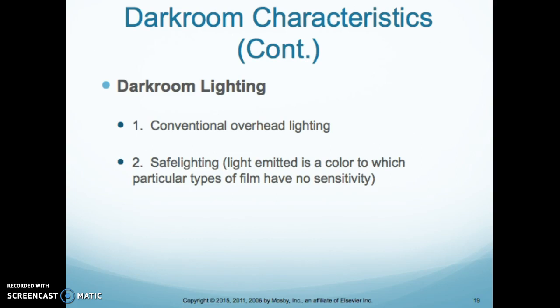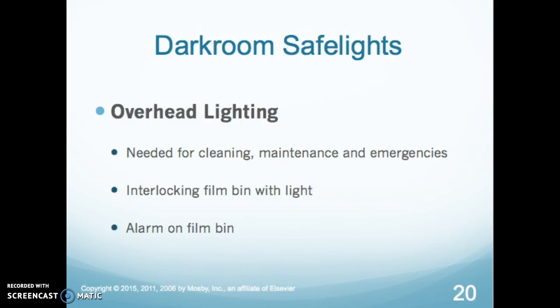So lighting within the darkroom. There's conventional overhead lighting, just like you would have in a normal department. And there's a safe light, which emits a color to which particular types of film have no sensitivity. It has some sensitivity. I shouldn't say no sensitivity. It has some, so you have to be careful still.